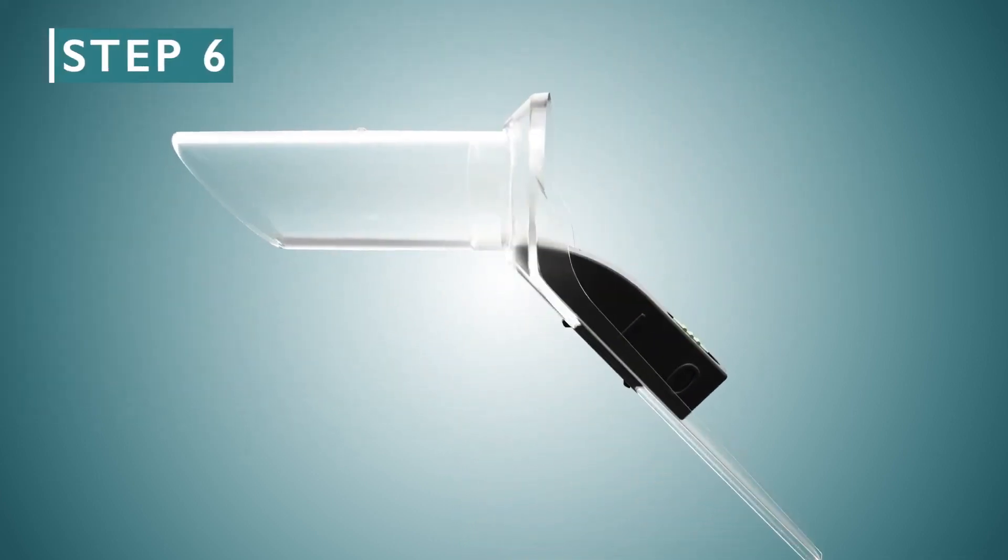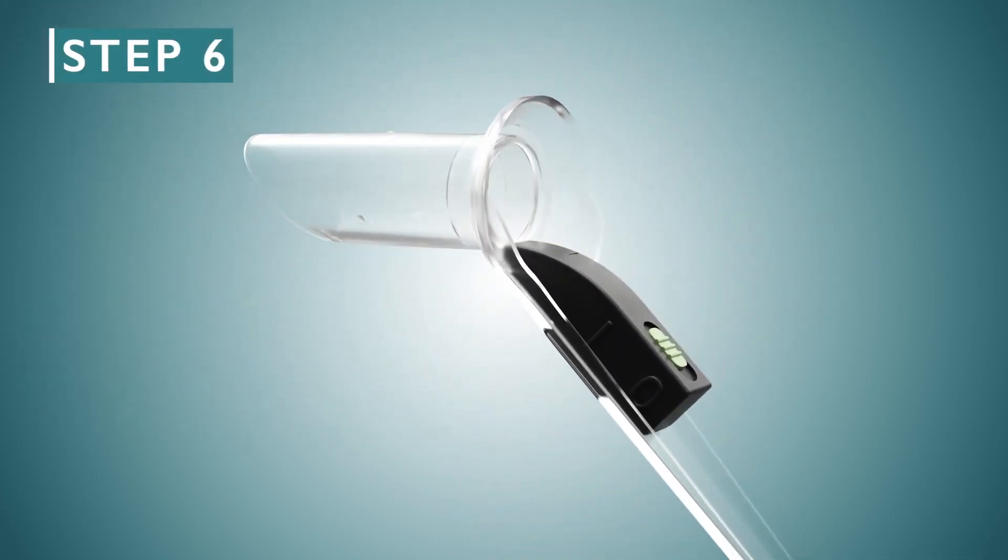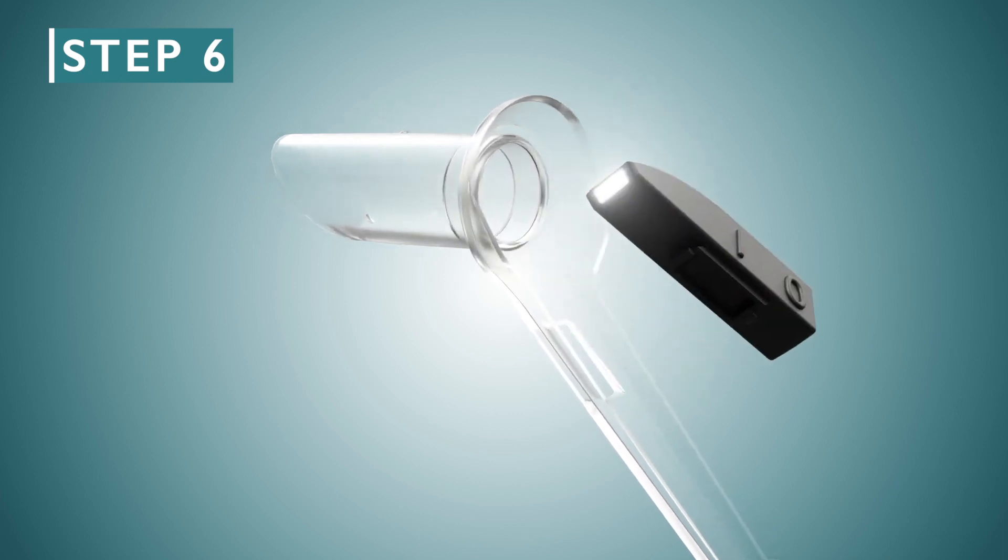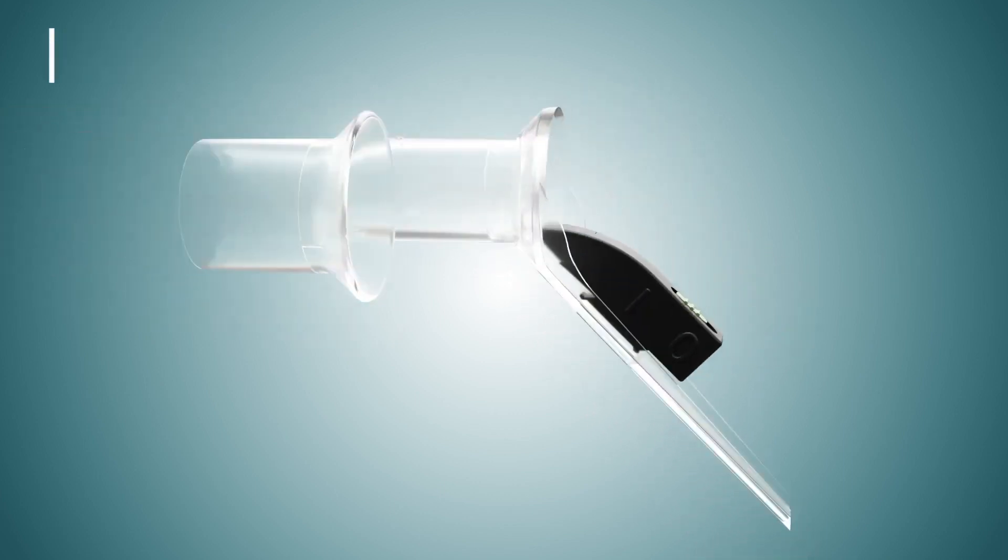Step 6. Once removed from the anus, easily unclip the LED module from the handle and dispose of it correctly. Step 7.